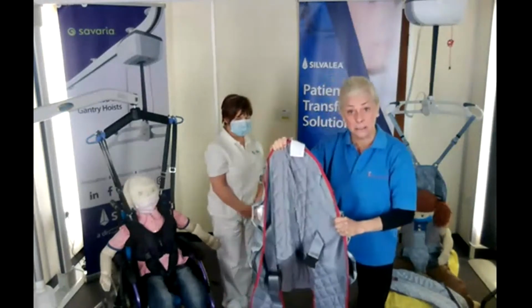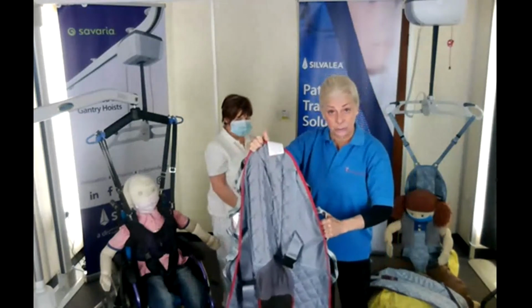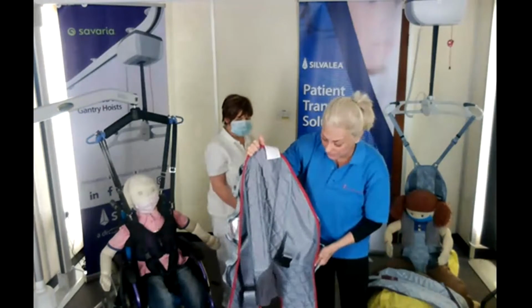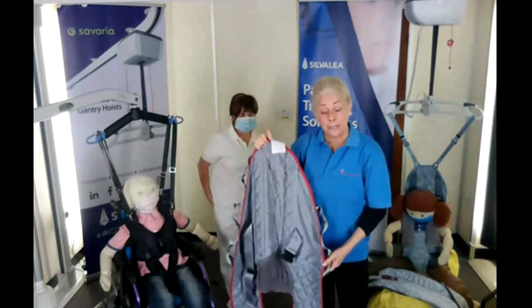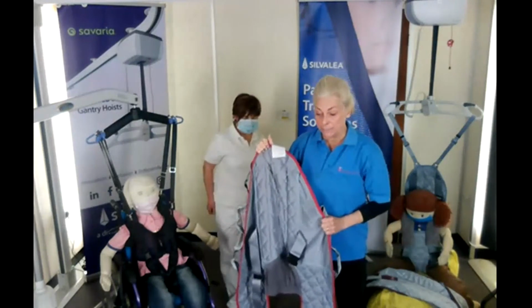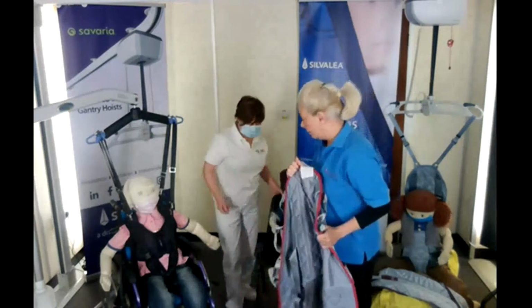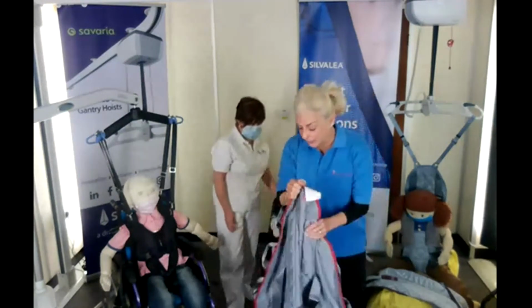So depending on the weight and depending on how many carers are required, they can use the handles to lift. Usually put on the floor. We're struggling today, and I do apologise. We're in a temporary room, which hopefully in the next few weeks we'll be moving into a new studio, but we are going to cope as best we can.